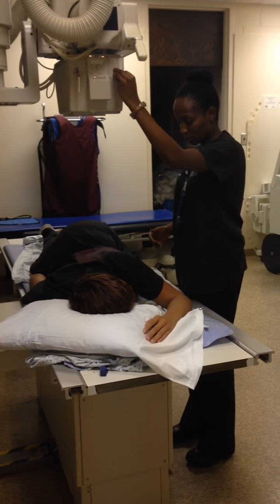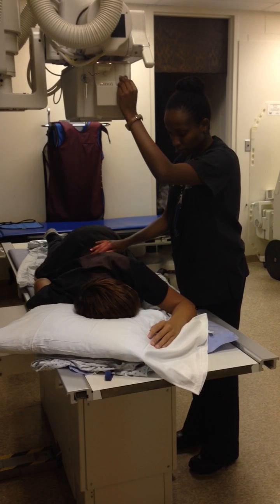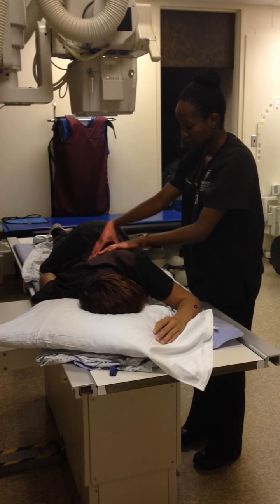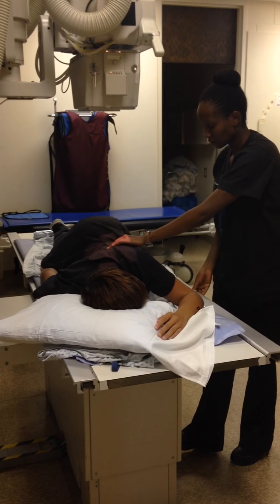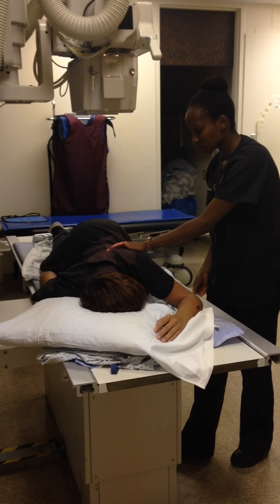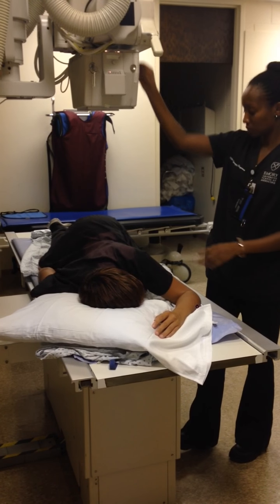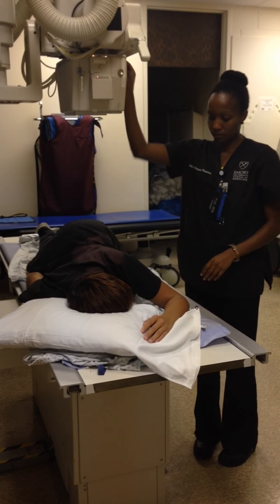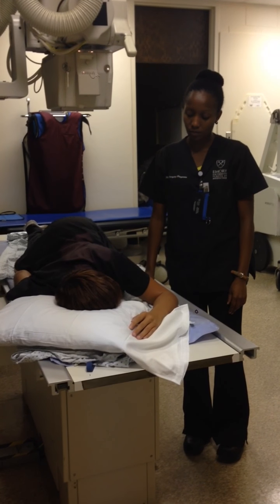Once the patient is centered, collimate to an 8 by 17 lengthwise field. And lastly, place the left marker directly on the cassette inside the table bucky on the lower corner of the patient's left side. The source to image distance will be 40 inches. For technical factors, the kVp will fall between 110 and 120, and the mAs will vary between 7 and 8.